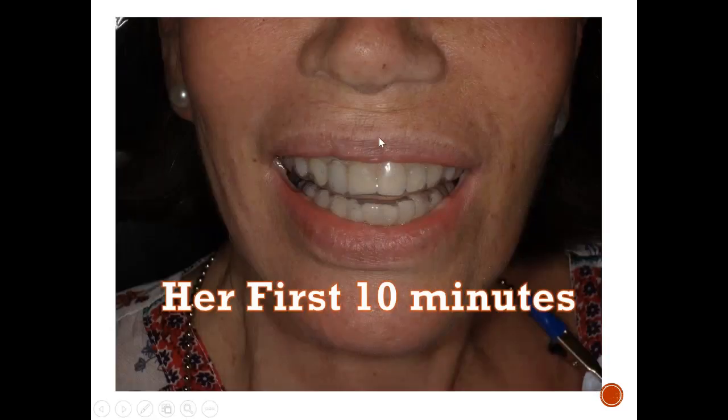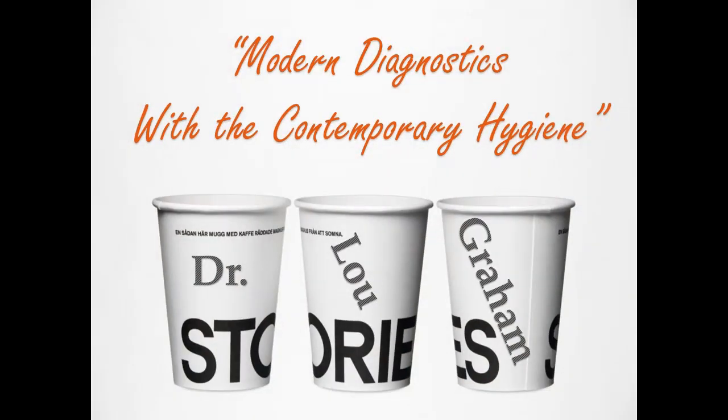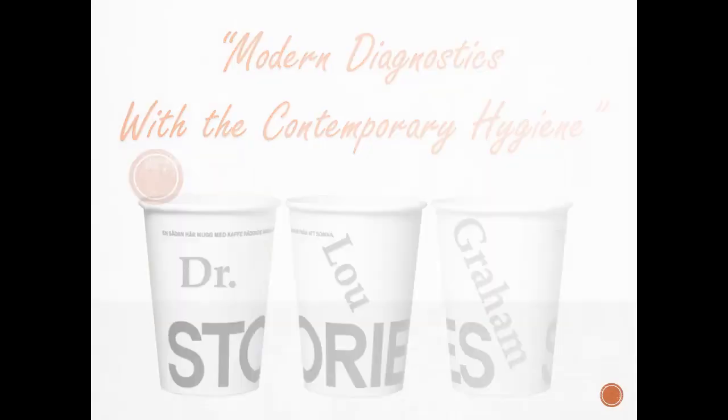And this is her first 10 minutes. After the try-in, she'll load the gel. We watch the timer. We rinse these out and off we send the patient. Two cases thus far. So let's talk about modern diagnostics with contemporary hygiene.